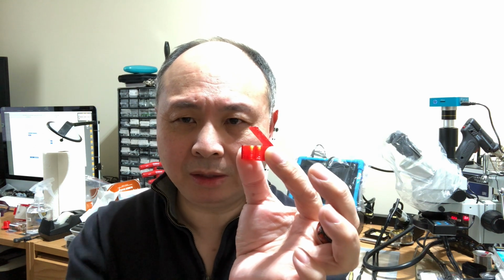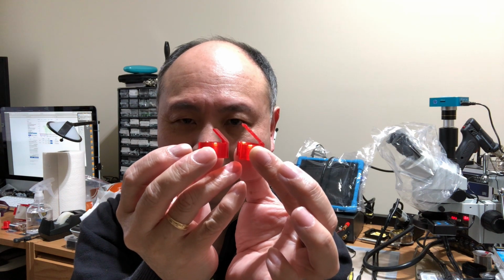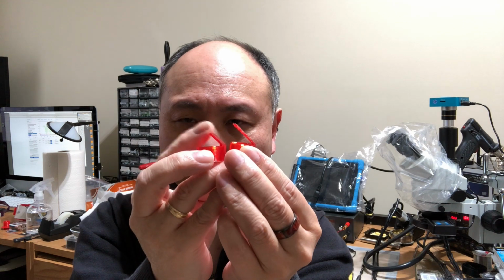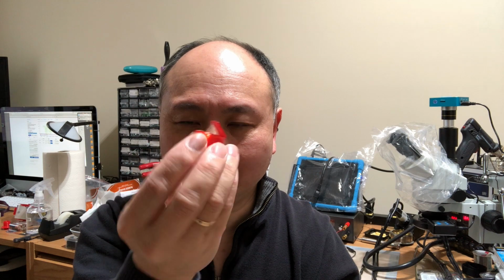Another minor thing, the deflector piece for the flutter valves, it turns out these are hard for some people to print. And so the STL has been changed so that the angle is slightly less steep. The overhang is reduced by about 5 degrees, and it's a bit shorter. So this should be easier for people to print and still has the deflection function which you want to make those flutter valves more rapid in function.